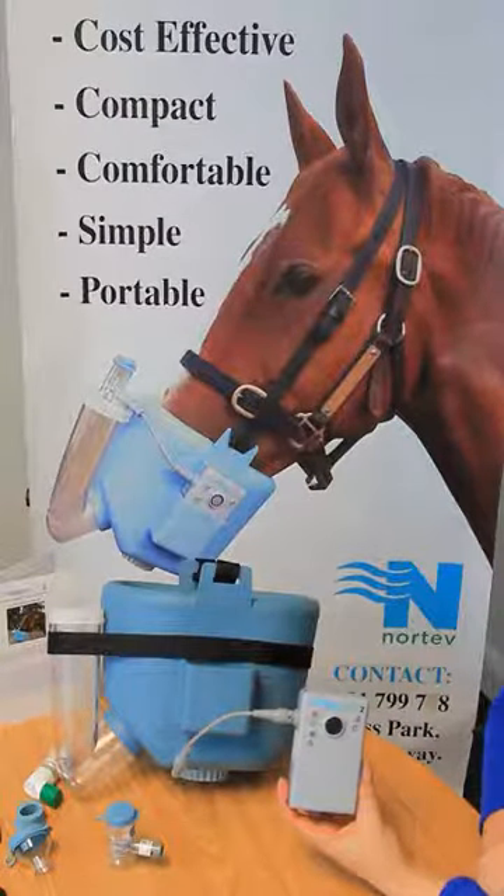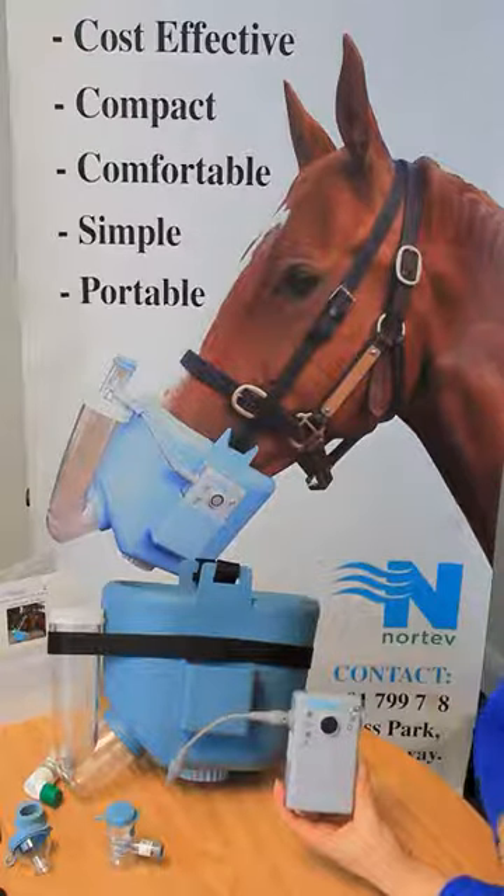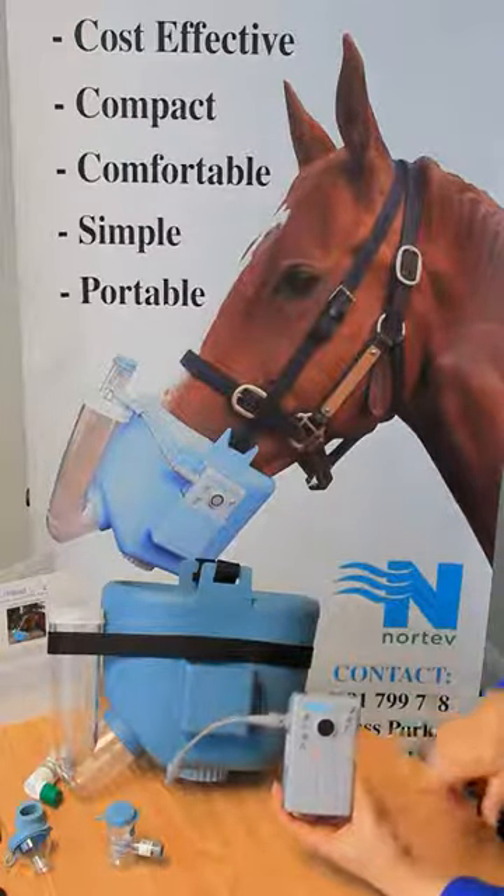Troubleshooting with your FlexiNev Equine unit. We have three lights in our controller unit: a power light, a warning light, and a battery light.